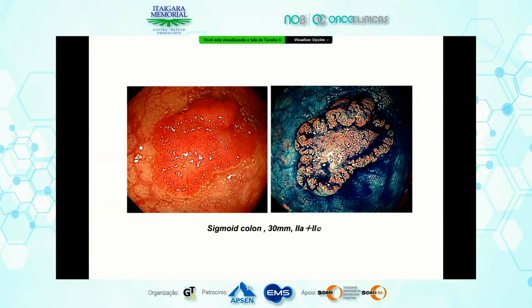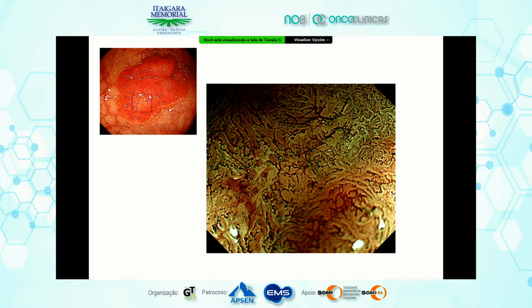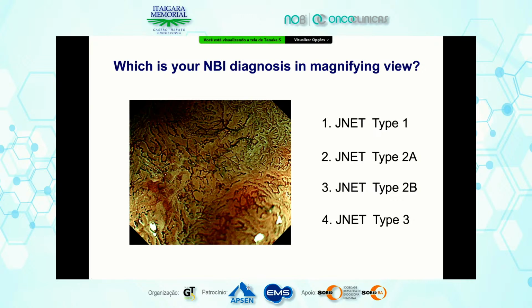Last case. This is 2A plus 2C, so-called LST non-granular type pseudodepression. This is NBI magnifying view. This part, this white part. Please diagnose, please vote.